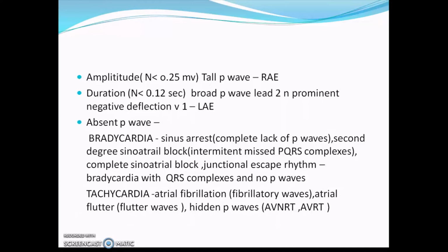Sometimes P waves are hidden in inferior leads, or they might follow the QRS complex. They might be submerged within the QRS complex, or sometimes they might be inverted. So you see this in AV nodal reentry tachycardias.